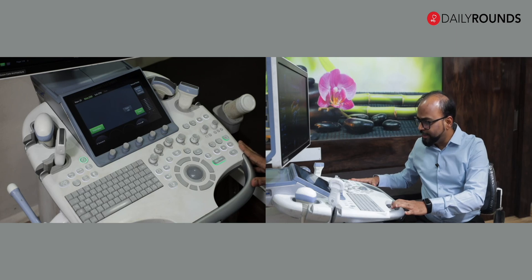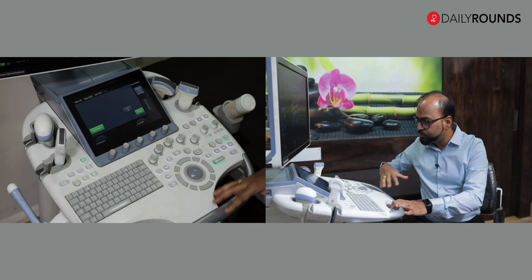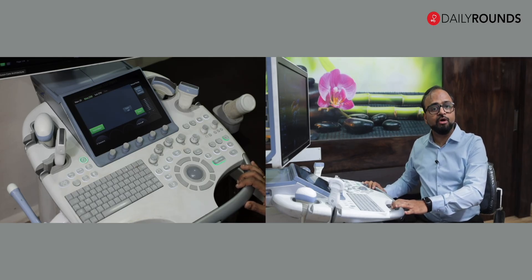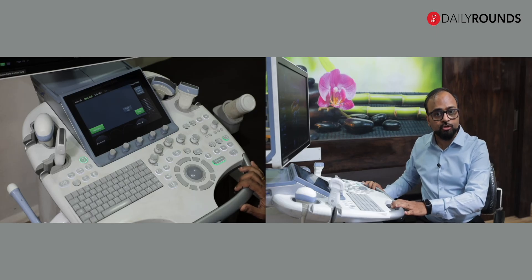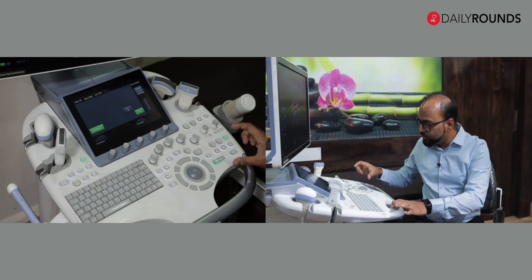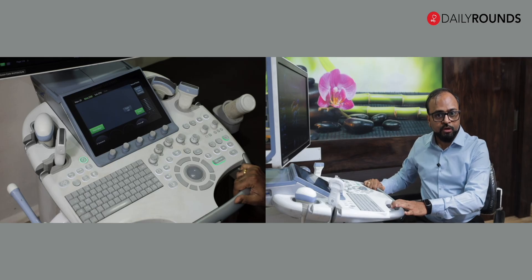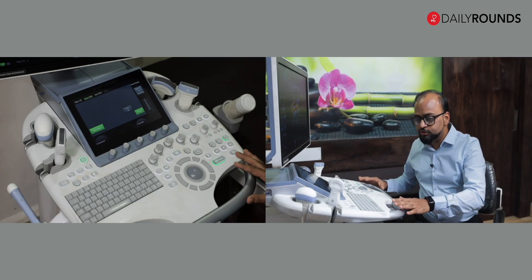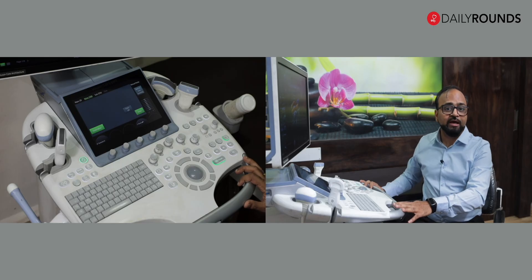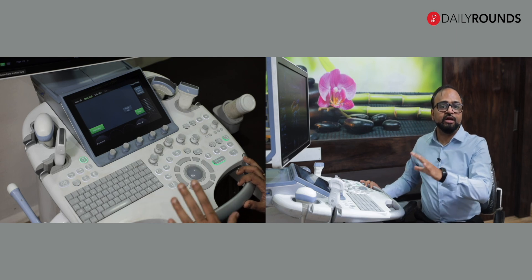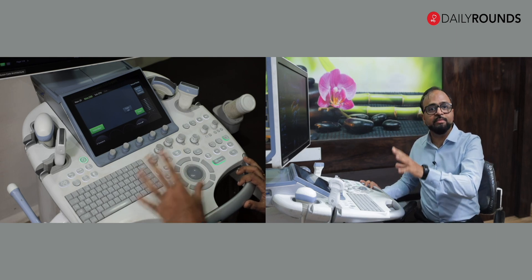Now we come to the console. If you look at the console, there are at least 20 to 30 different buttons. There is actually a specialty of ultrasound called knobology. Knobology teaches us the best way to use each of these individual knobs in order to optimize the image so that we get a good image. You will get lost when you look at this console for the first time, but I am going to hold your hand and tell you what each of these knobs does and how we can use it to get the best ultrasound image.